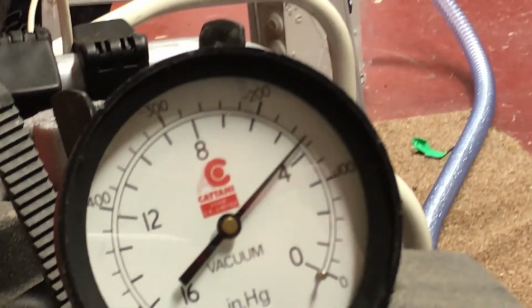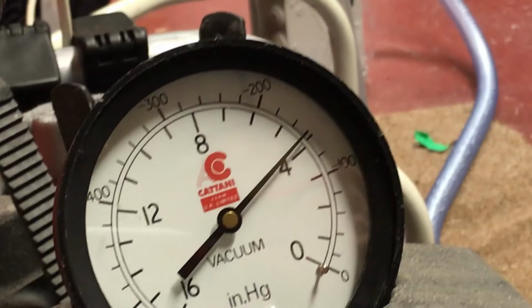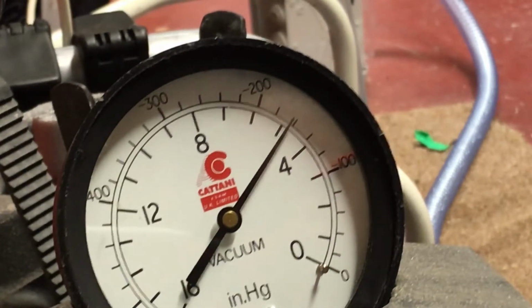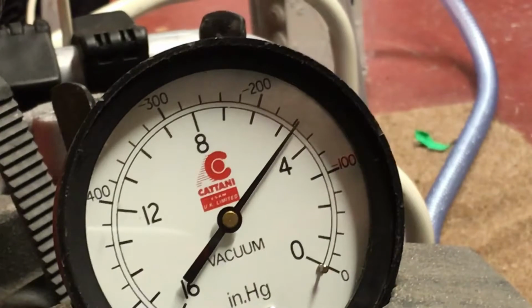As you can see, the flow up into the pump from the suction tip is quite high, but it's actually pulling very nicely. The main water is on the inner side of the tube and pulling up very well, with a fairly constant flow. There's a bit of fluctuation, but nowhere near as bad as the previous software, so I'm pretty pleased with that.